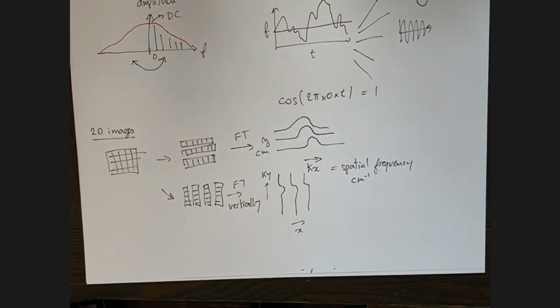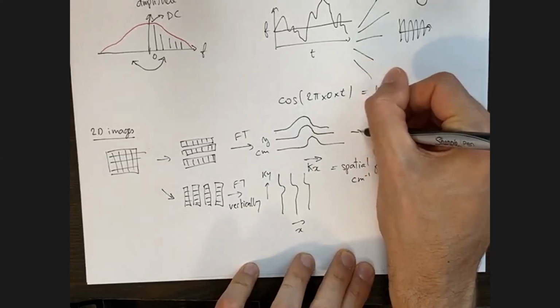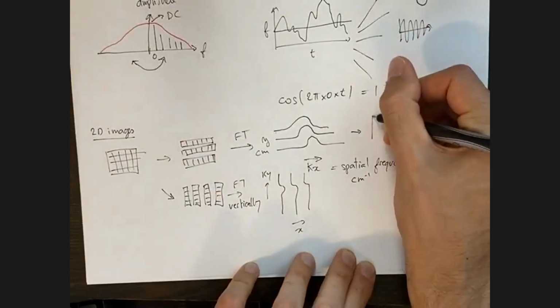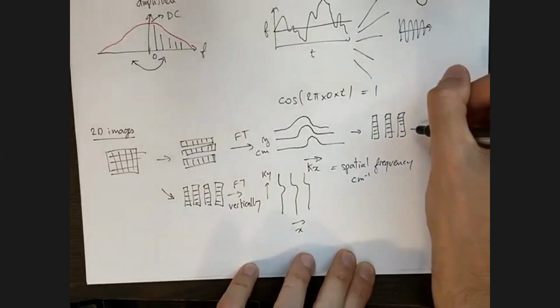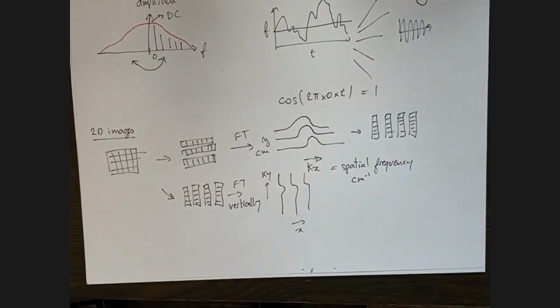What's interesting is we can also apply both. We can apply the Fourier transform on the rows of the image and then on the columns of the image. So taking those spectrums, we have rows here, and we can turn them into columns, such as this here. I'm going to turn these rows into columns by just chopping the image into a different orientation.